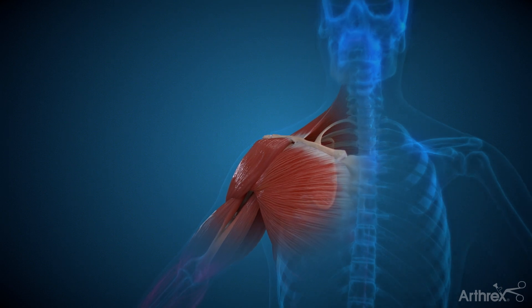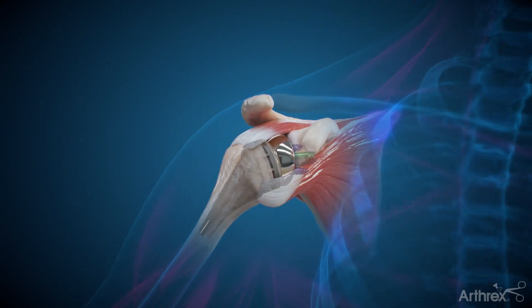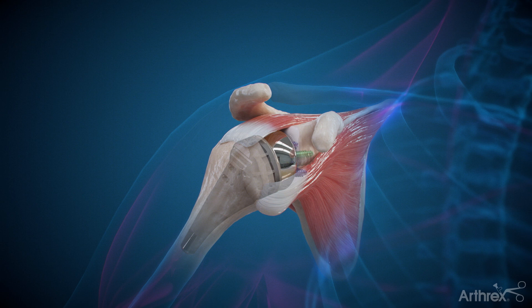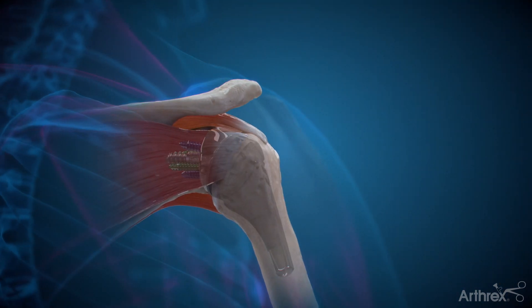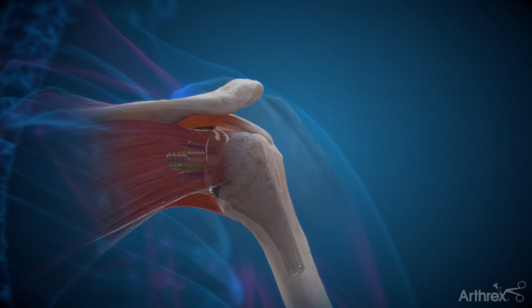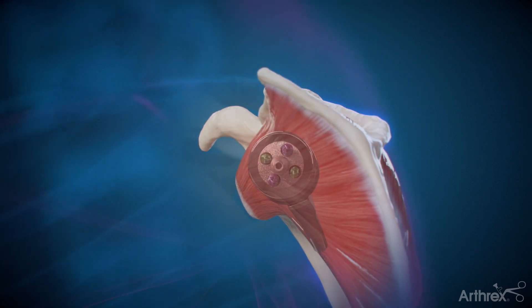Reverse total shoulder replacement has become increasingly common over recent years due to its unique design and ability to treat rotator cuff failure, which was previously untreatable by an anatomic replacement that requires the rotator cuff for stability.